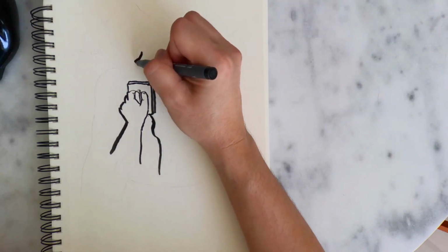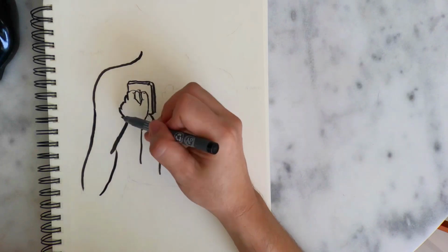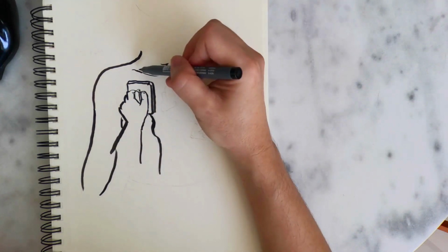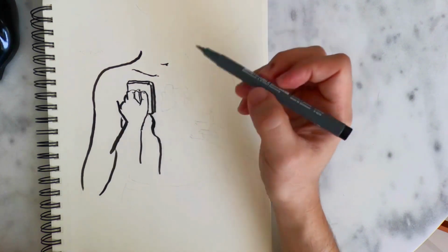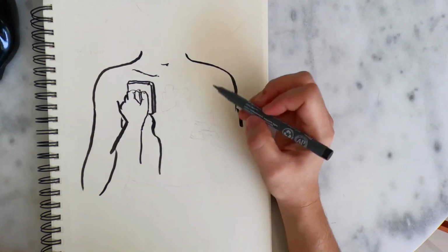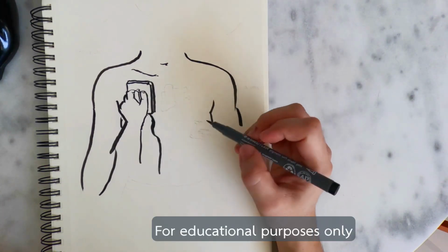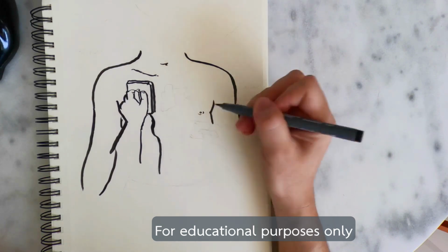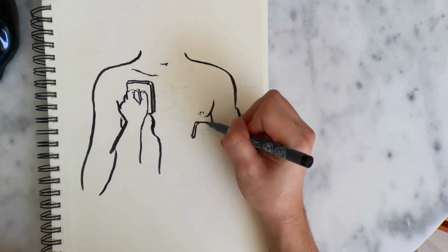The general public can simply look at the cartoon to see where to place the pads before peeling off the stickers. For the right side, we find the right clavicle and place the pad just below the clavicle near the area of the sternum. If you are a doctor, you would use the same method. This is the correct placement that is recommended. Now we place the pad on the right side of the patient. We locate the right clavicle and then place the pad just below it, slightly lower than the clavicle. For the other pad, we will attach it to the left side.